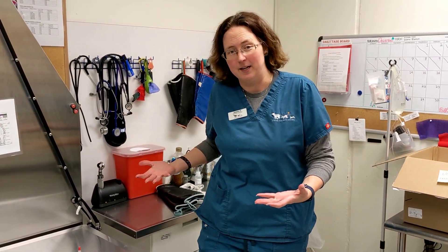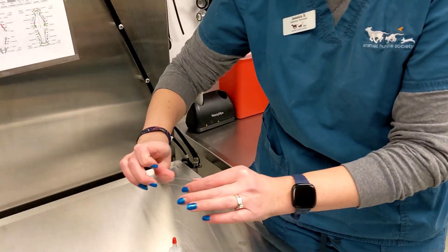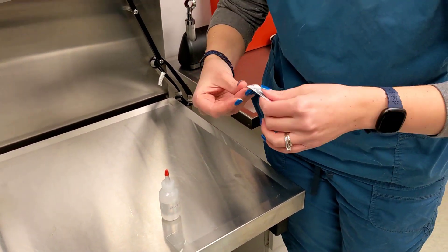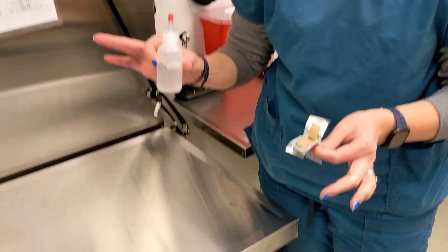To start with, we are going to need some supplies. Our supplies are pretty simple today. What we need is a microscope slide, we need a sterile surgical blade, and we need some mineral oil.